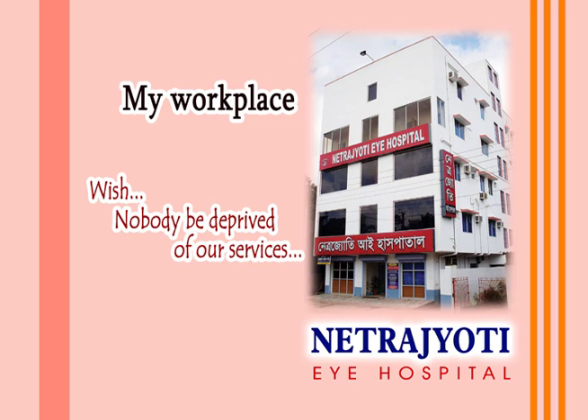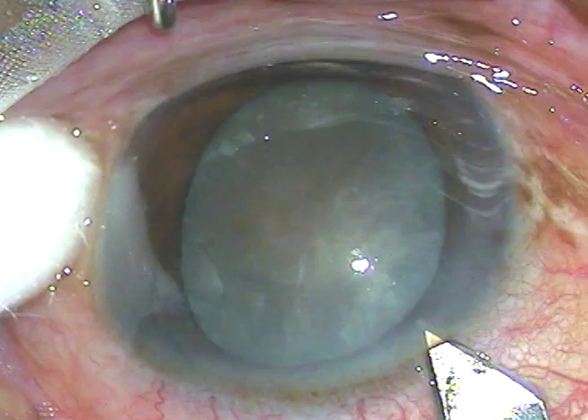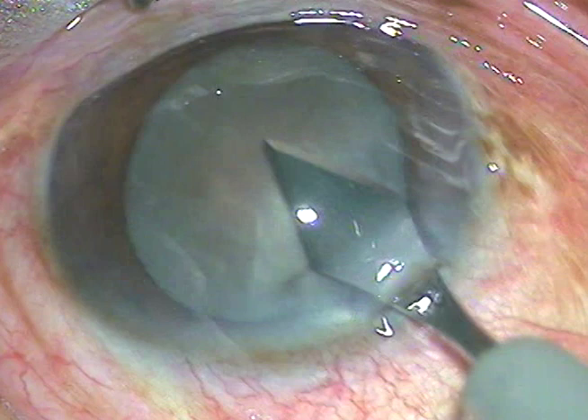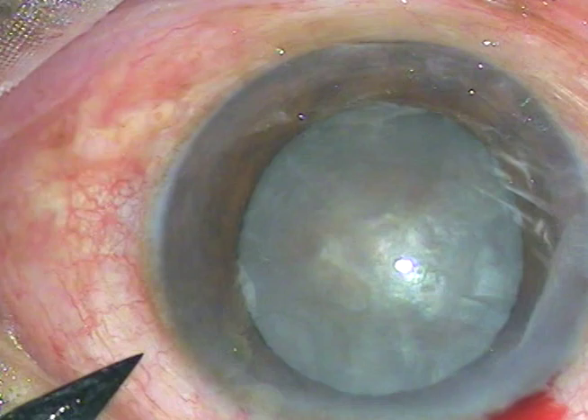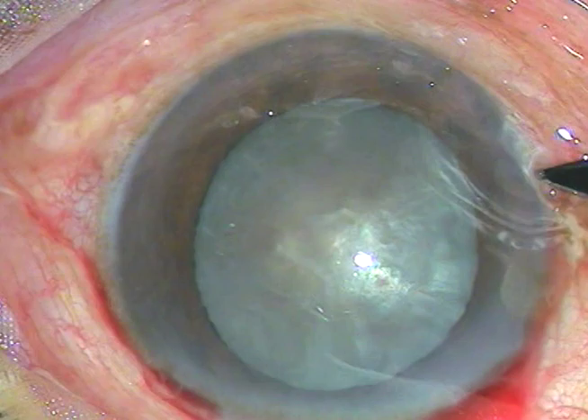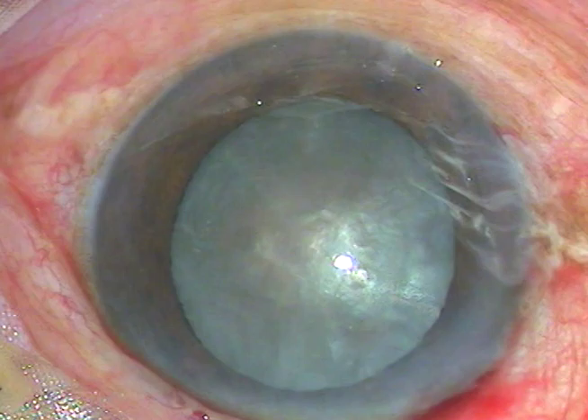Welcome to my hospital at Ranaghat, India. In this video you're going to see management of a white hard cataract. The main incision has been placed at a selected site — this is a 2.8 millimeter keratome incision on the posterior aspect of the limbus. This is a side port on the left side of the main incision, about 3 o'clock hours away, and another side port on the right side of the incision.